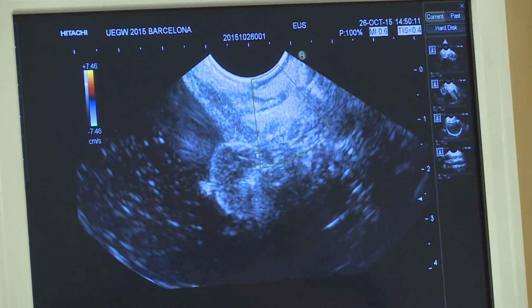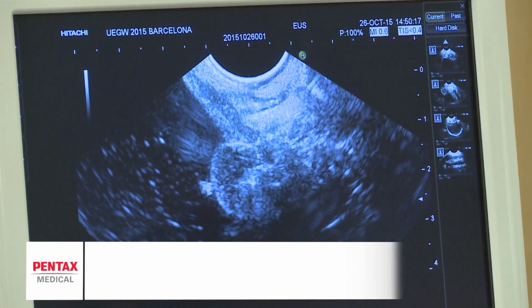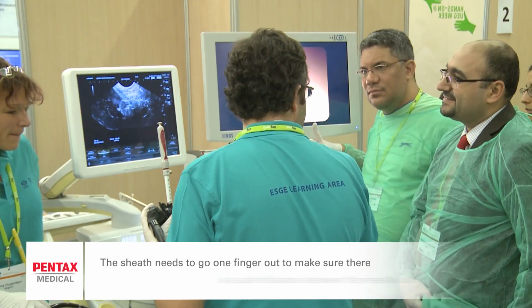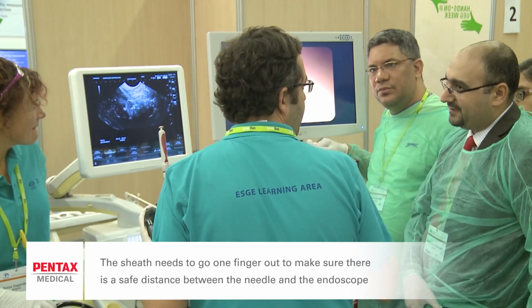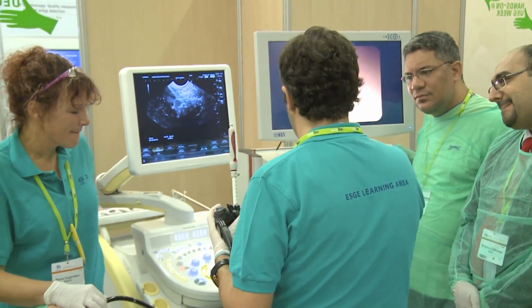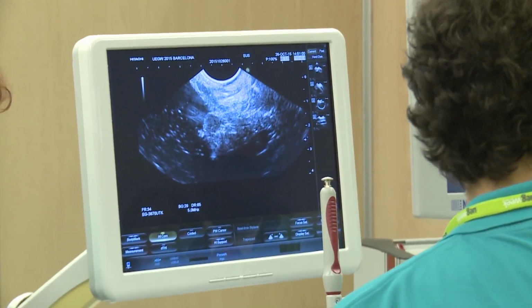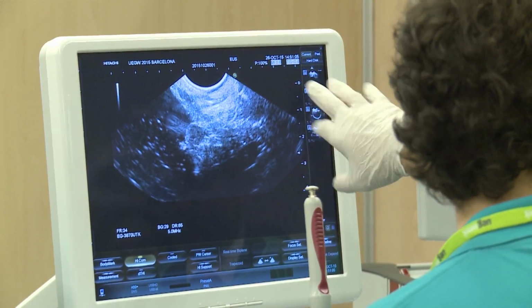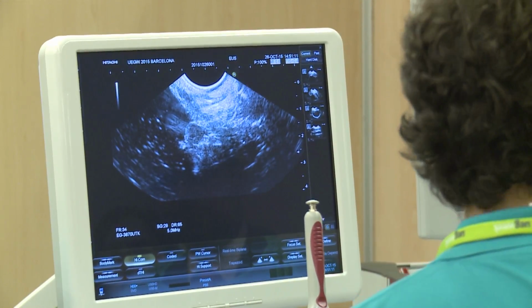There are no vessels in the models, but it's a good idea always to use Doppler, not to puncture any kind of vessel. Now the sheath needs to be at least 1 finger out of the line. So that means that you are not going to break the scope. Because the only problem is that if you try to place the needle out of the sheath with the sheath too much inside, you can make a mess. So you just need to put the sheath out, so it's for sure there is no connection between the needle and the scope. Okay?